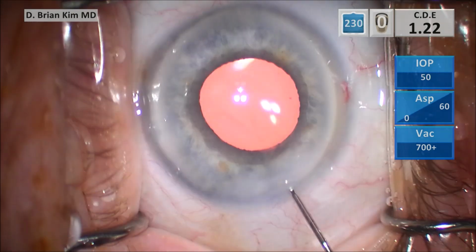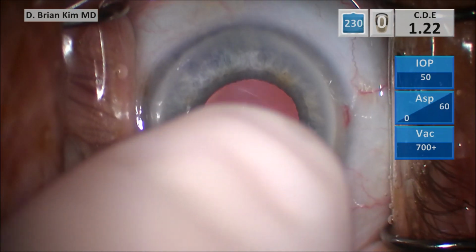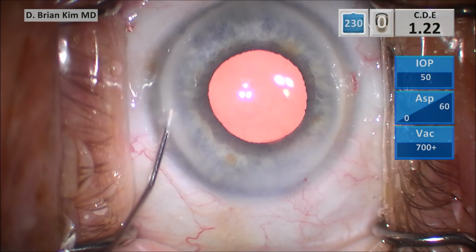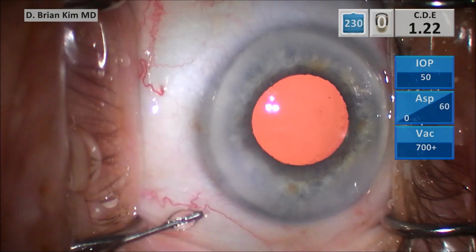I never feel worried that I can't get a lens out. Again, because I'm not going after lens pieces with vacuum, I don't ever have to worry that I'm going to accidentally grab something I shouldn't, like the posterior capsule. So using the chopper is really a very powerful way to take advantage of a very safe way of grabbing pieces up out of the bag.